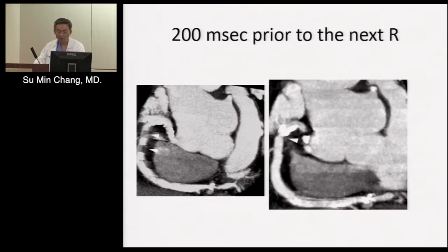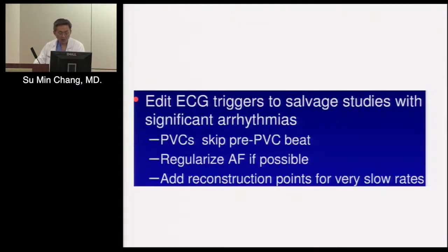Or you can do absolute time, which works as well. So pay a lot of attention to patient rhythm before you image the patient, because that will affect the protocol you will use in scanning the patient.